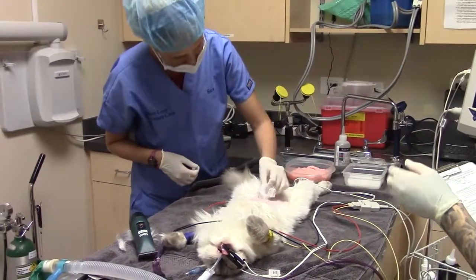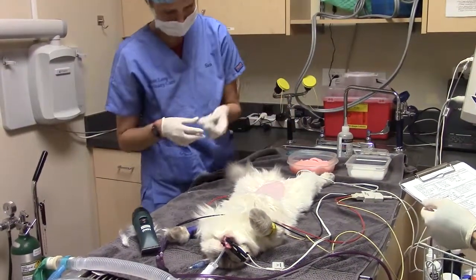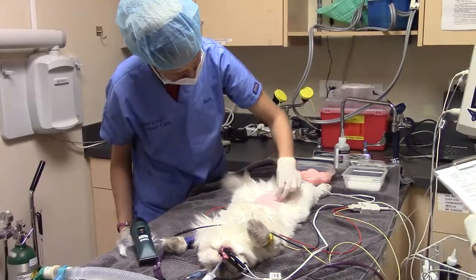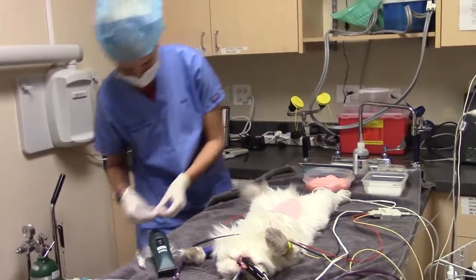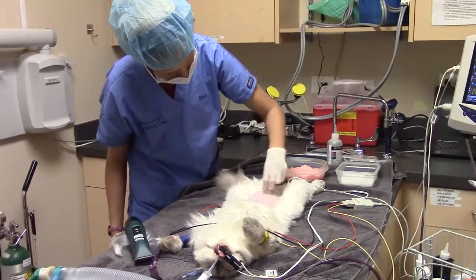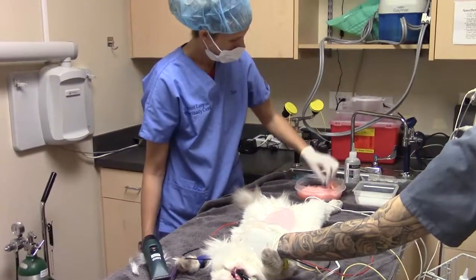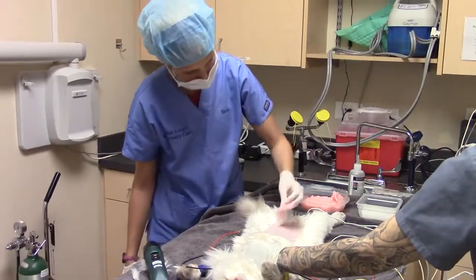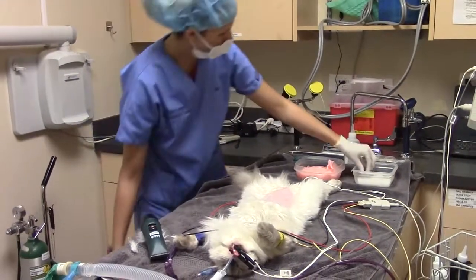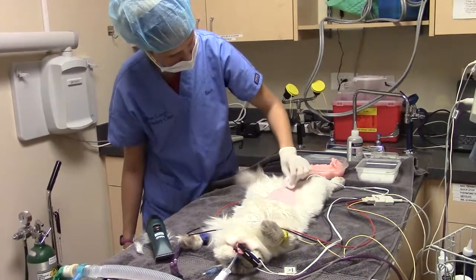Now we've got alcohol. Then chlorhexidine again. And we'll do three of each — alternating chlorhexidine and alcohol — for a total of three rounds each, finishing with one more of the alcohol.